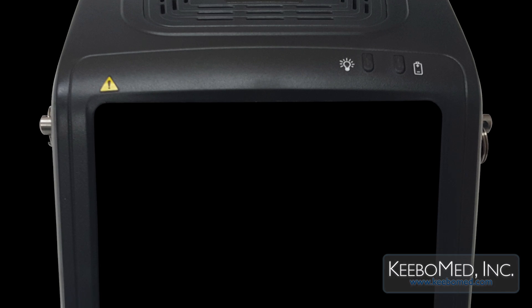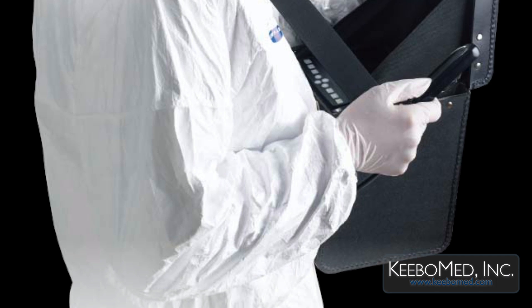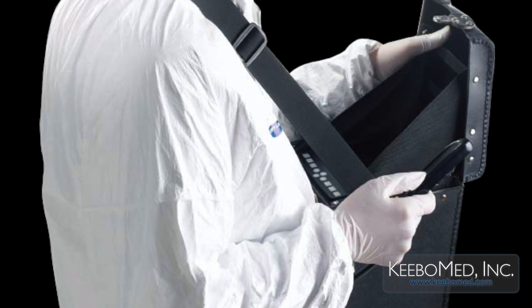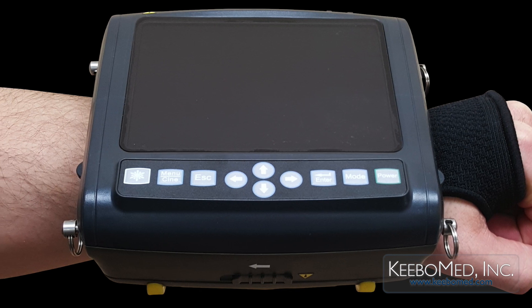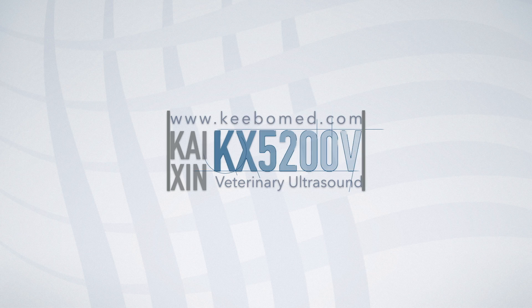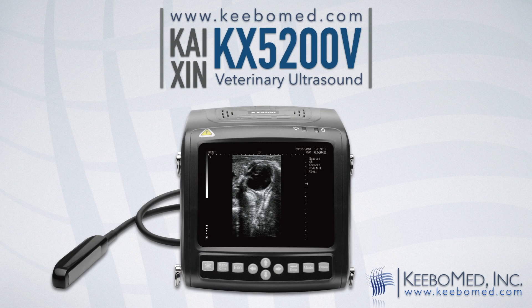The KX5200V is known for its high quality, adaptable features, and affordable price. It has proven to be the perfect choice for many veterinary practices. For more information or to purchase the KX5200V, visit our website at KeeboMed.com.